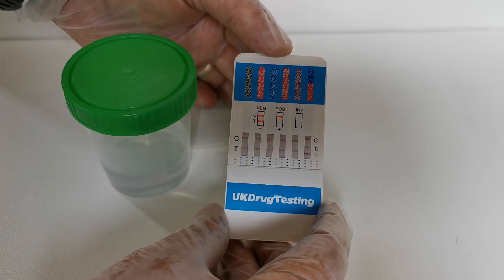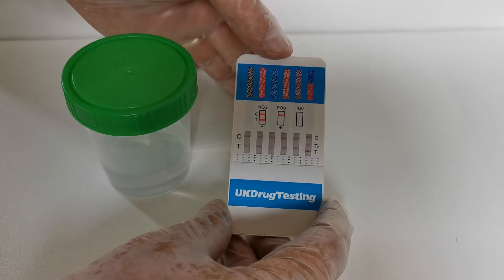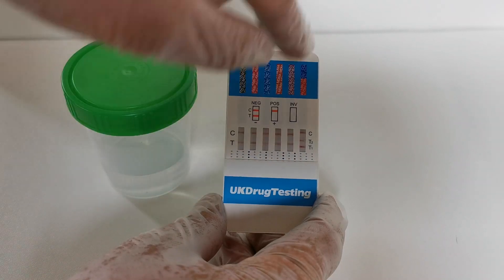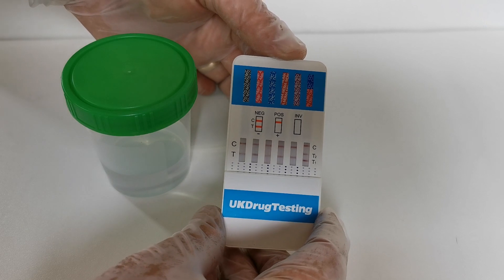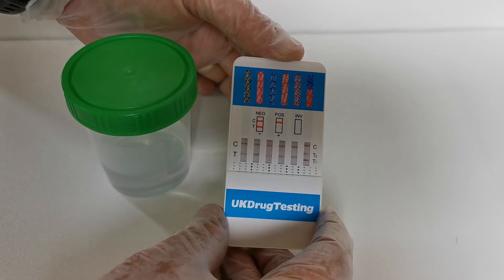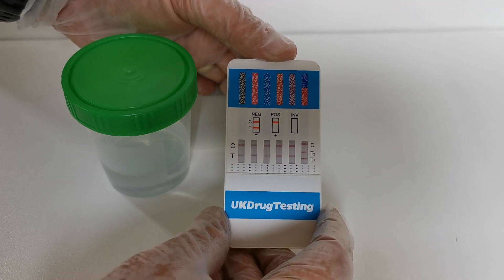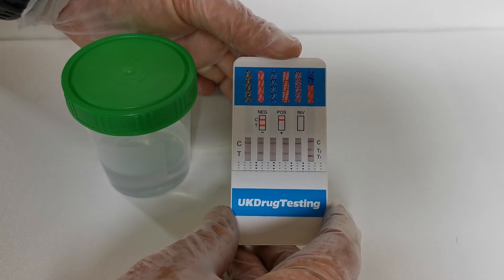At the top of each of the results columns you've got the drug abbreviations for that particular column, and on the right-hand dual column it's split between cocaine at the top and opiates at the bottom. Along each control line area you've got a nice firm red control line showing in each results window. It's very important that the control line is present and strong, as it indicates that sufficient urine has been absorbed by that wick and absorbed well beyond the test line areas. Between five and ten minutes you're looking for the presence or absence of a test line.